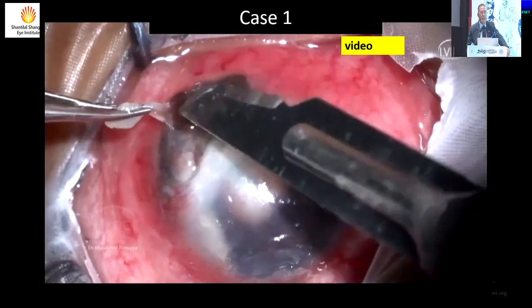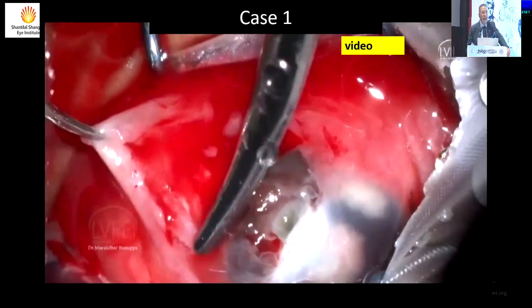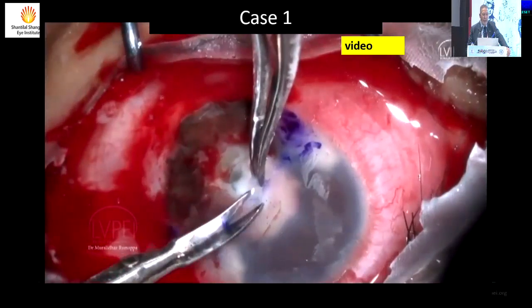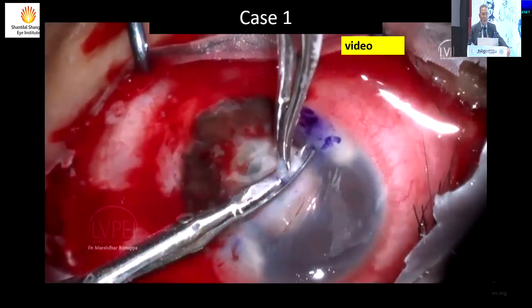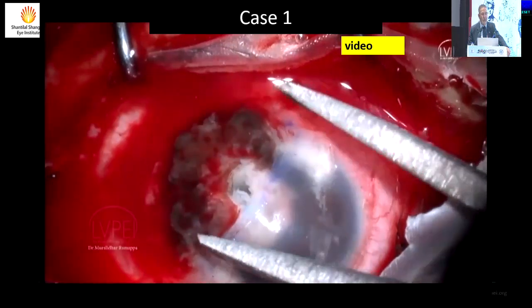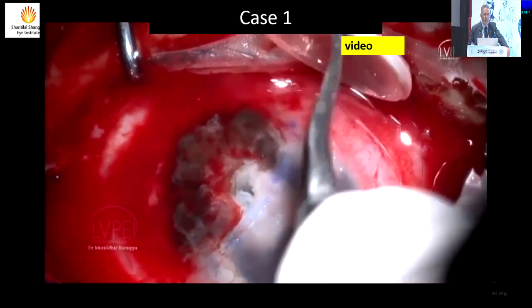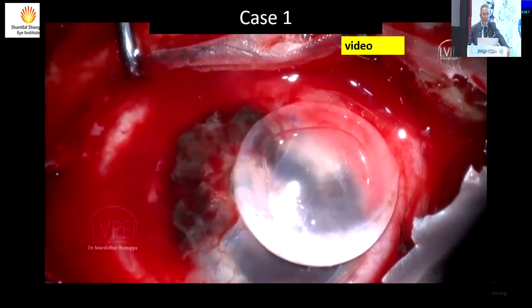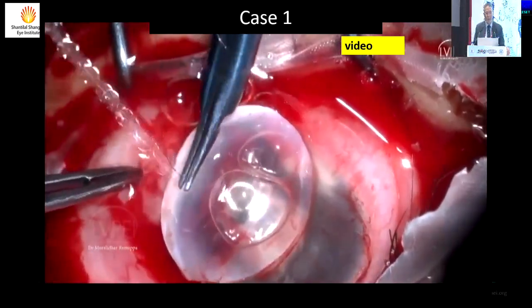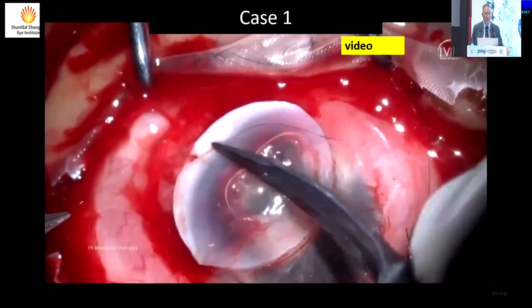So in a peripheral area, there are more than 1 ways to skin a cat. Dr. Kavita showed us elegantly the use of a tenon patch graft. You can also, if you have tissue available, use a cornea there. The important thing is to go beyond the edge, because the edge may be cheesy and difficult to suture. So go a little beyond, use a marking pen and go a little beyond. Then put your graft, the entire cornea there, so that you get an idea of how much you need and how much to cut. Err on the side of a little larger, because you can always trim it after that.